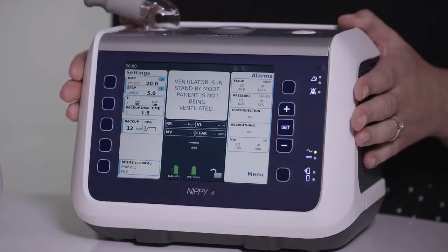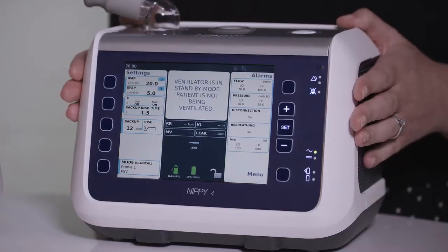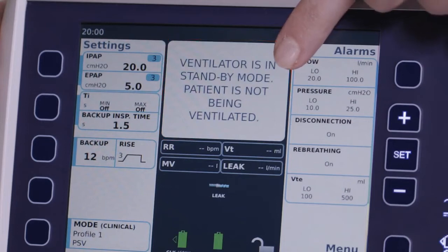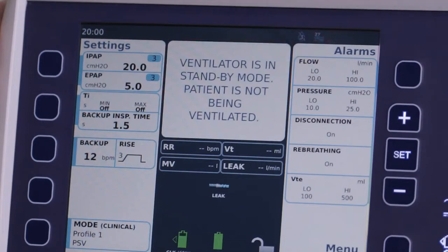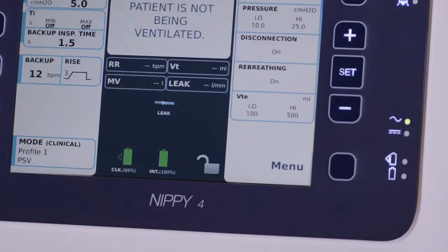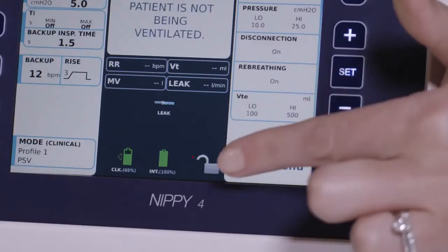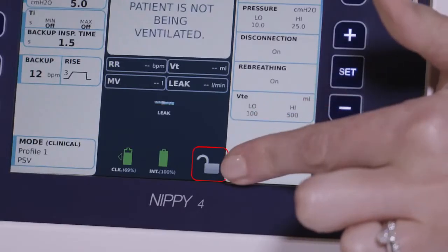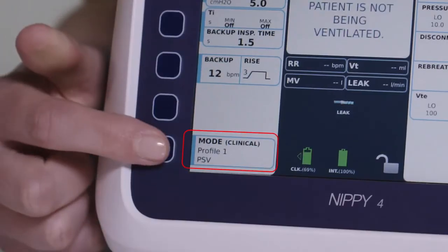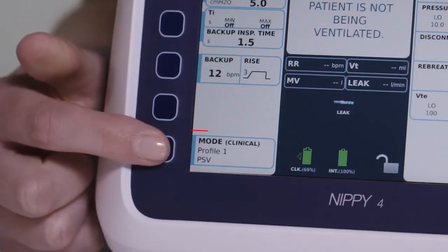At first the device will go into a standby mode where it states that treatment is not yet active. In order to change any clinical modes or patient settings you must be in the clinical mode, which is shown by an open padlock on the screen and in the mode box in the bottom left corner.